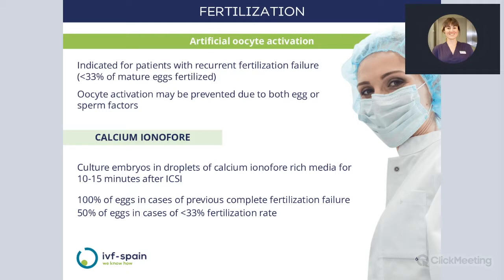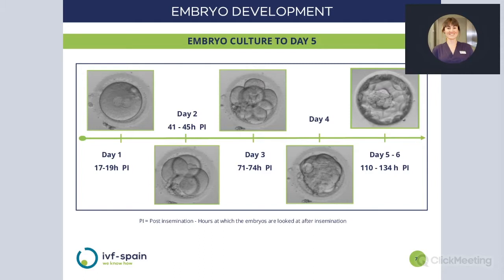Of course, you don't want to randomly use this technique if it's not necessary. What we sometimes do is we apply this media to all of the eggs if the patient has had cases of complete fertilization failure. And if it's just a low fertilization rate, we consider applying it only to half of the eggs to see if this is really helping the case.